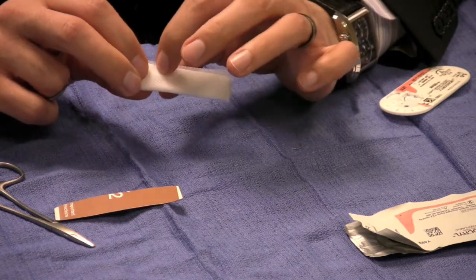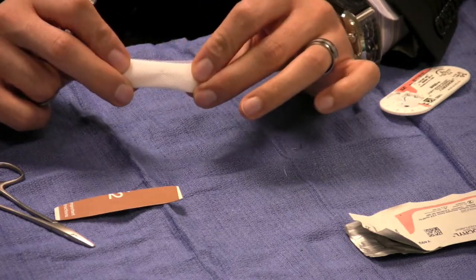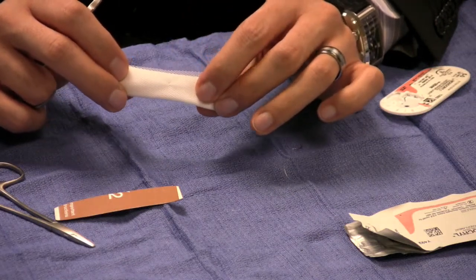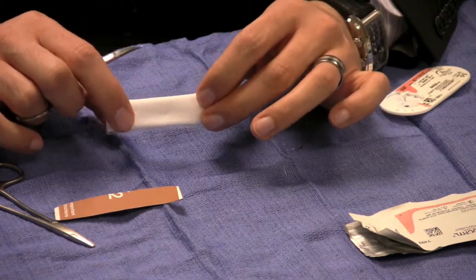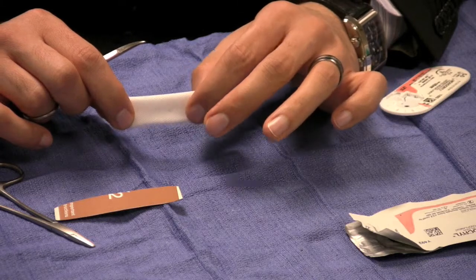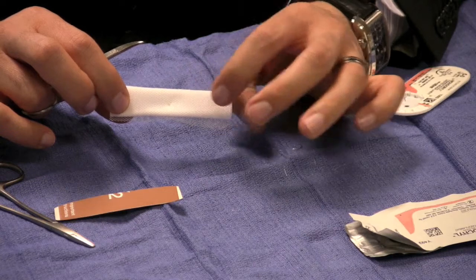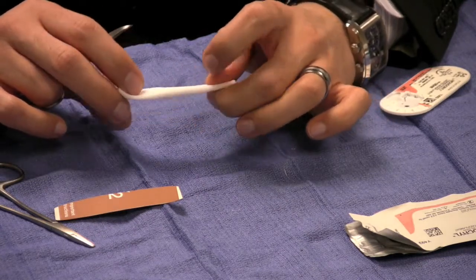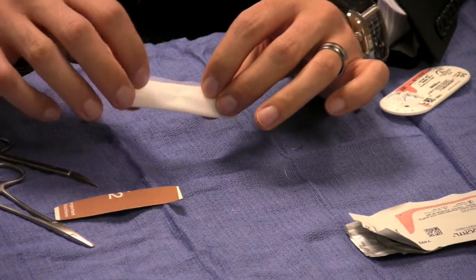The disadvantage is the same pores make it a little bit harder to remove this chin implant in case of infection where you have to remove it. But again, it's doable. It's just a little bit more technically challenging. And this implant, once it's shaped and trimmed into its special size, can go from an incision inside the mouth underneath the lips or from outside underneath the chin. That's the patient's preference. For older patients, from the outside is perfectly fine. Younger patients that don't have creases under their chin will usually go through the mouth. However, when you go through the mouth, there's a little higher risk of getting an infection.